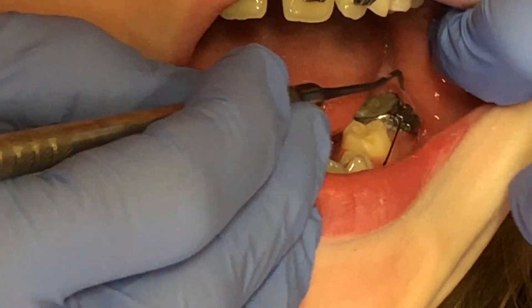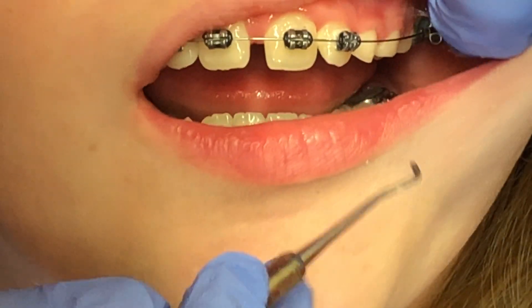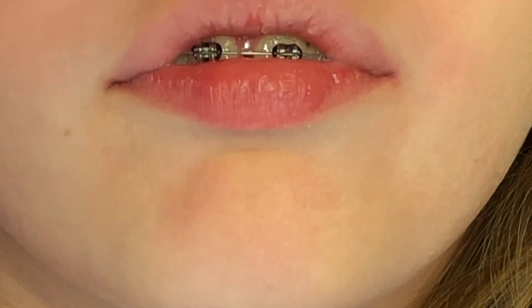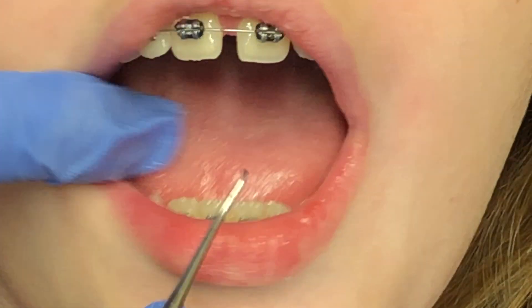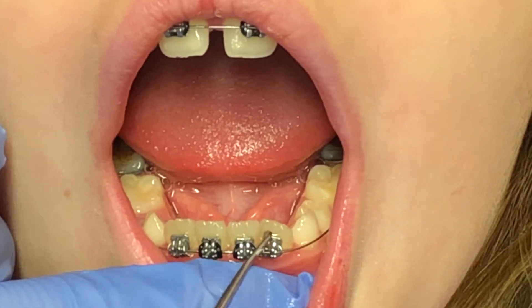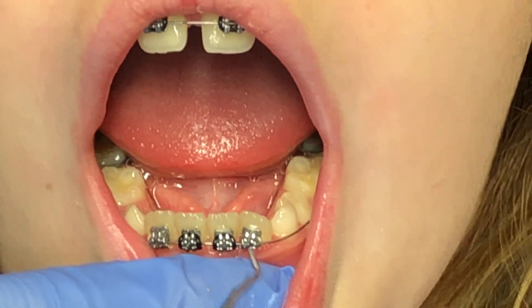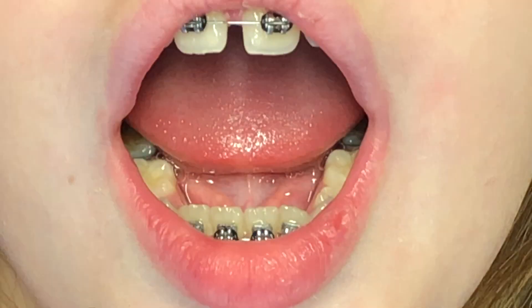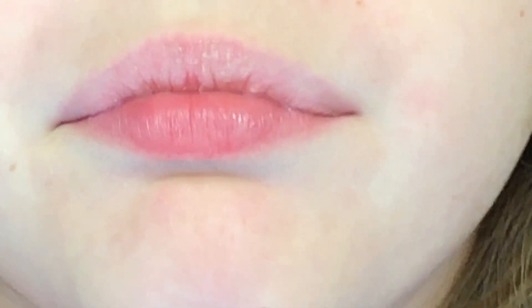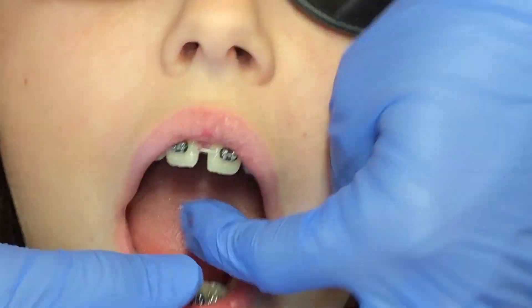These are baby teeth, so she's got this span here. I would say for the hard stuff, she should either cut it up or tear it — just for now until we see — because she needs a thicker wire but she's not ready yet. See how that tooth is turned? You have to wait until that tooth lines up before we can get to a thicker wire. When she comes back — it's like two weeks — the expander is to be taken out anyway.